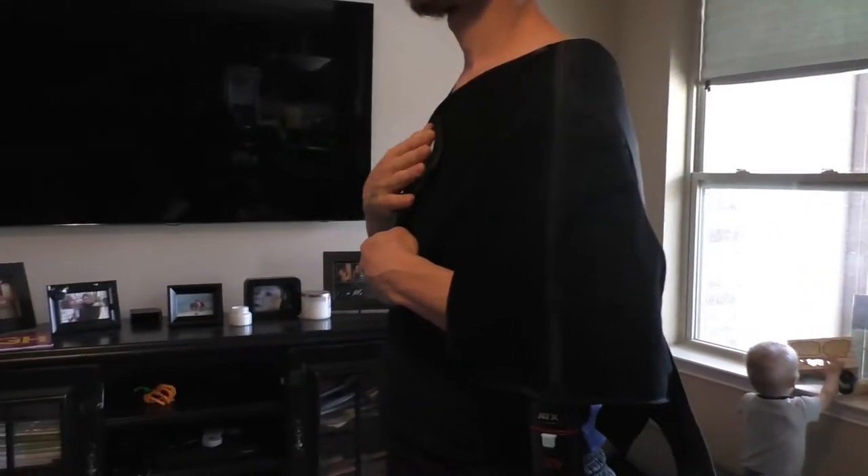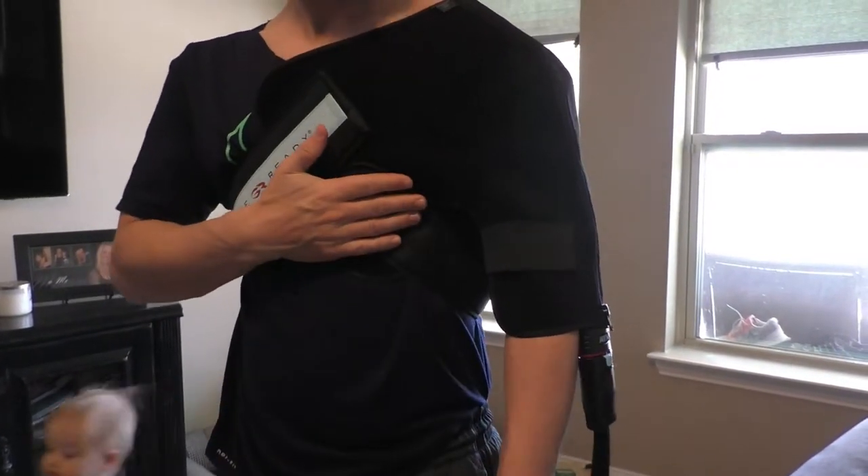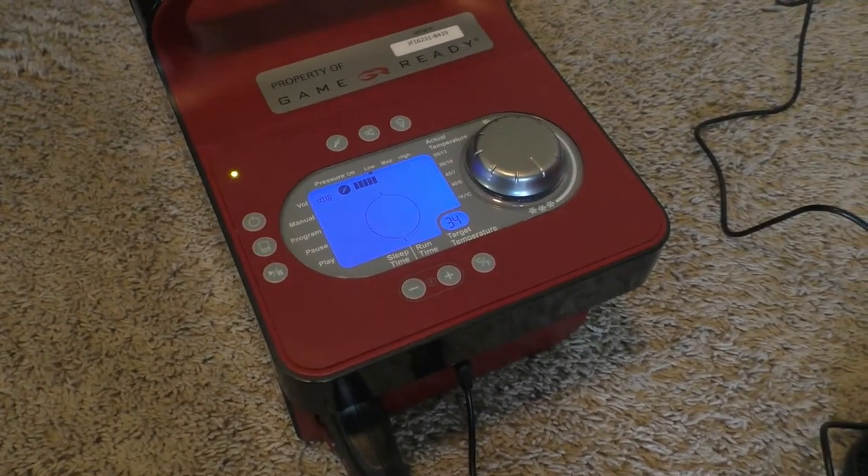After securing the wrap or sleeve correctly with the velcro — which is very easy — go ahead and turn the unit on. The screen will now light up and you are ready for the settings.